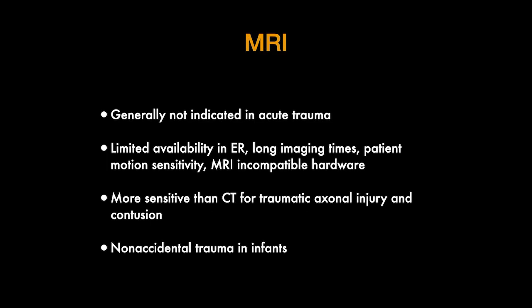MRI is generally not indicated in acute trauma. The reasons for this are that it's usually not readily available in the emergency room. Imaging times are often prolonged. It's sensitive to patient motion, and patients may have MRI-incompatible hardware.